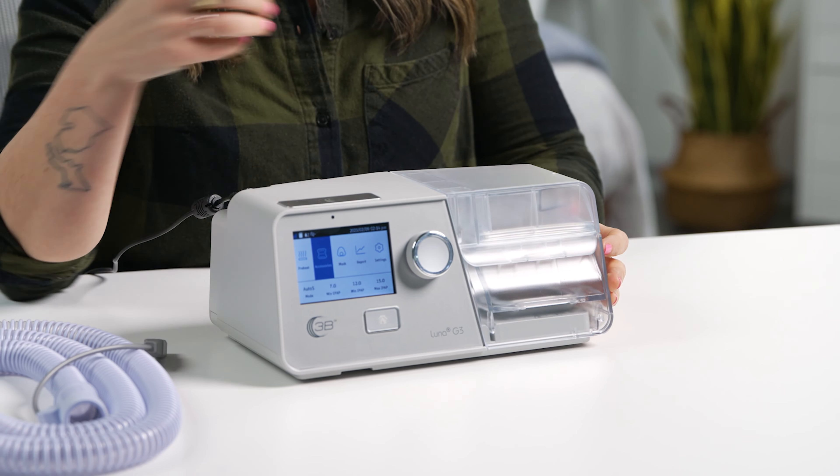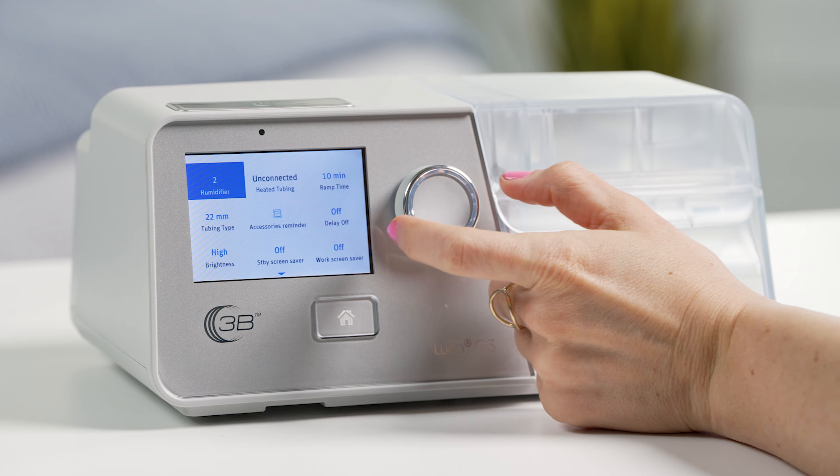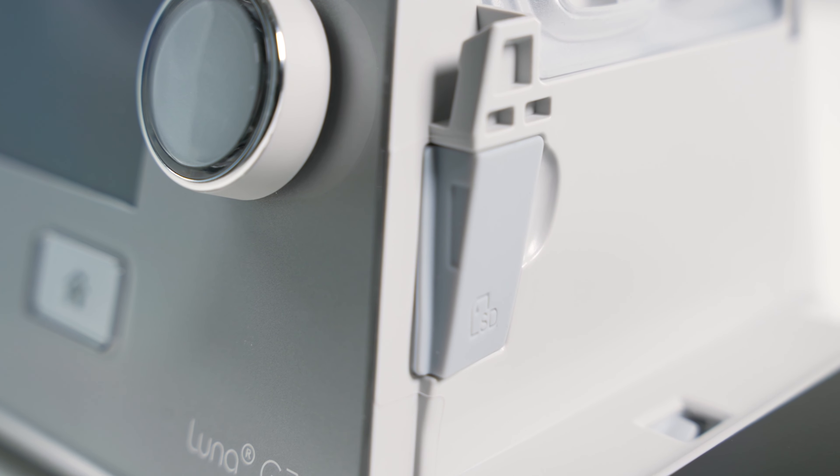Ease of use is another strong point. The Luna G3's digital display is bright and easy to read, and there's a dial system that lets you switch between options easily. Thanks to modem and Wi-Fi connectivity, submitting compliance data to your doctor is a hassle-free process. The interface also lets you adjust temperature and humidity settings to reach your ideal comfort level, and the Luna G3 offers a decent customization range for both.